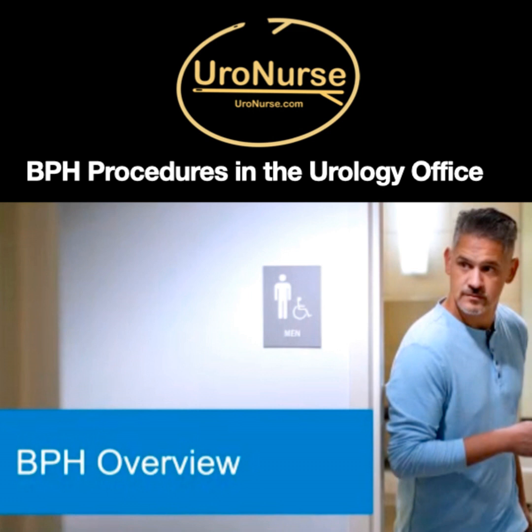Now, I will tell you that part of the differentiation between Urolift and Rezum is the 90-day global. There is a 90-day global for Rezum. So every one of these visits that you're seeing the patient back for the dysuria and checking post voids and such is going to be included in the global. With Urolift, it is not. So that is, again, part of perhaps the motivation that if you're on the fence and you like both treatments, that may enter into the decision-making process.